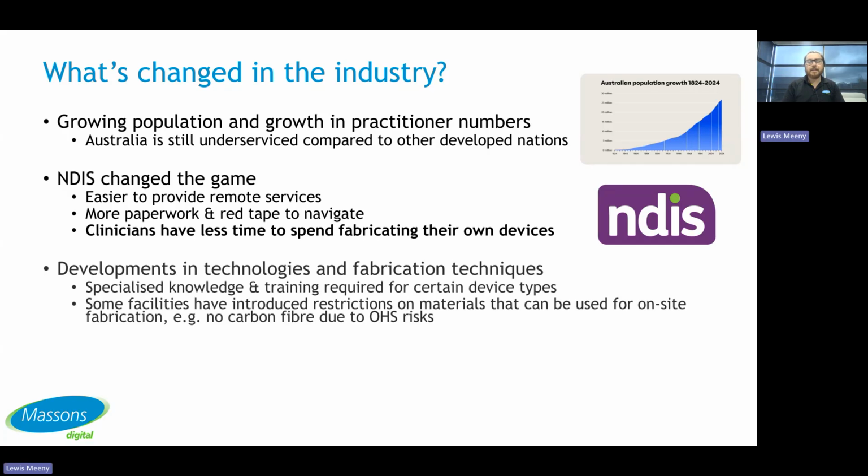Over the last while, there have been developments in technologies and fabrication techniques as well. So there might be specialized knowledge and training to do certain devices. Some facilities as well have some restrictions on what materials they can use. I've heard of no carbon fiber in some places due to OH&S risks. So where we have had these developments, they have changed what we can fabricate, but potentially not just what we can do, but what we might not be able to do as well.